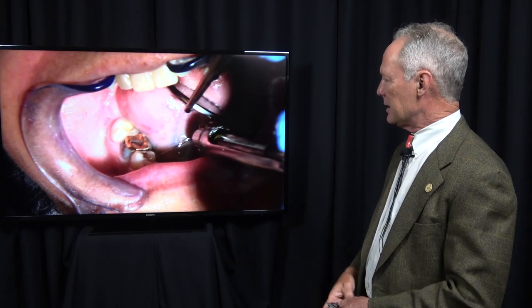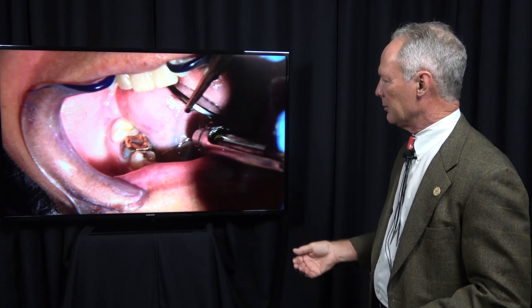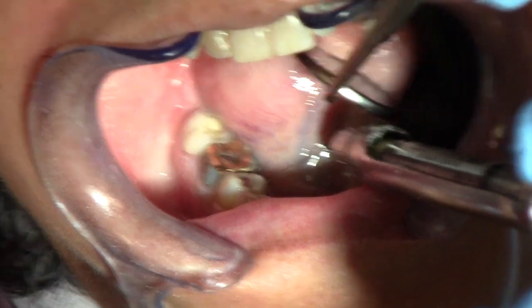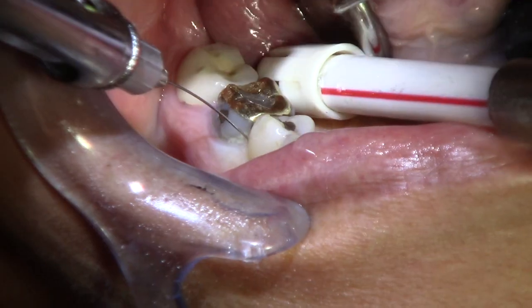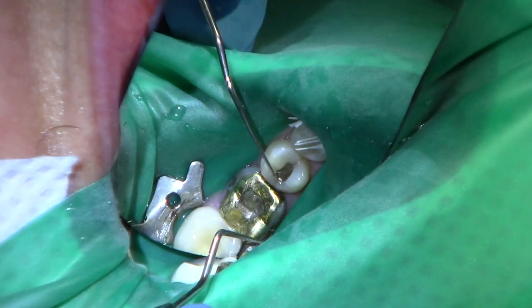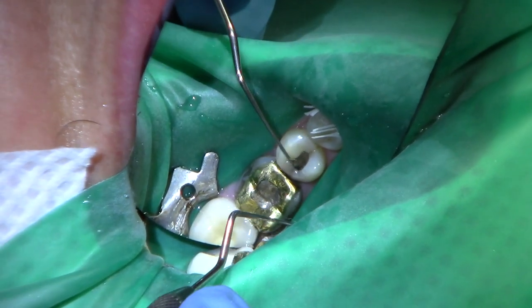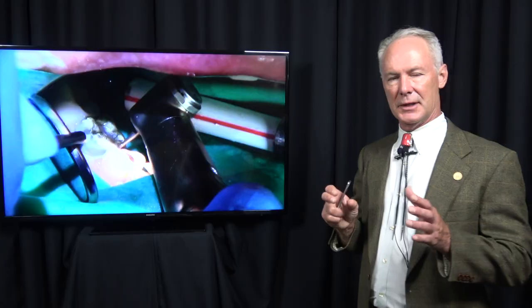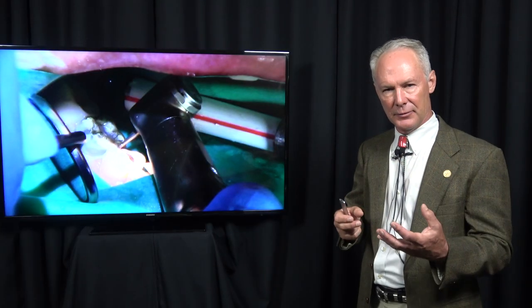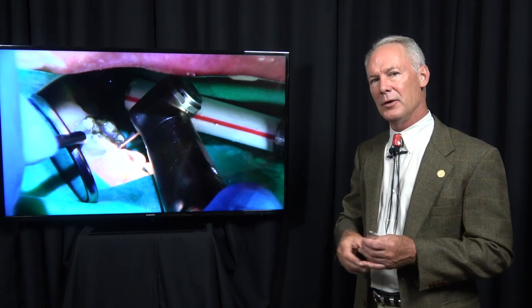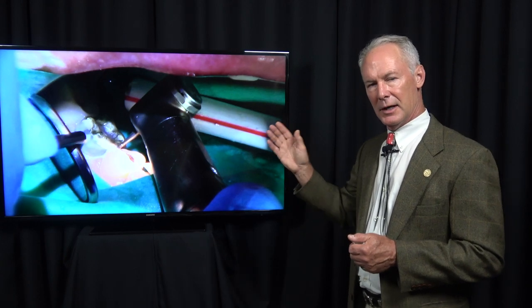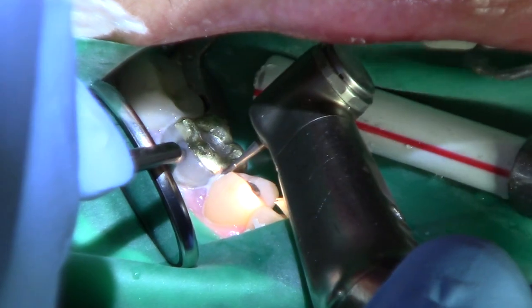In these cases, we're going to provide mandibular block and then intracrevicular local anesthetic with epinephrine on the tooth that's not had the endodontics, the second bicuspid. See the crack right there? The tooth wasn't hypersensitive. If it had been hypersensitive or painful to biting pressure, then I would have normally done endodontics on the tooth.